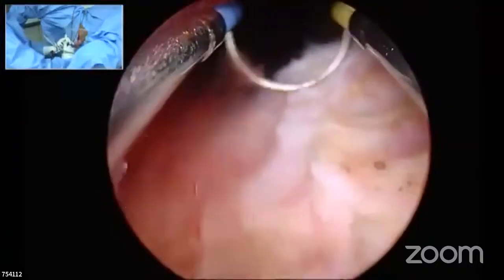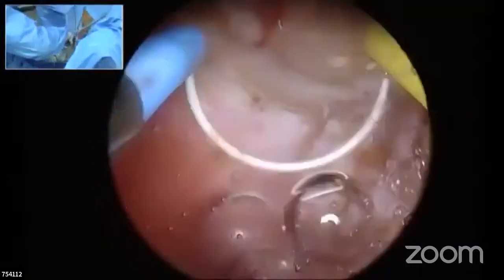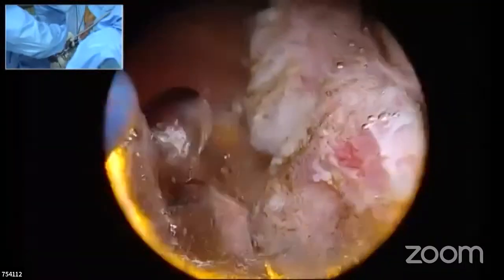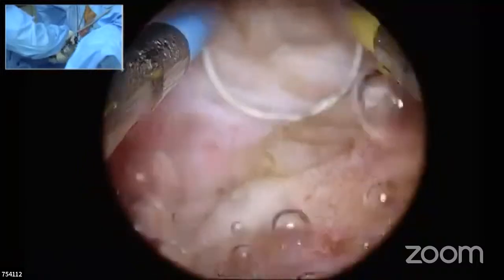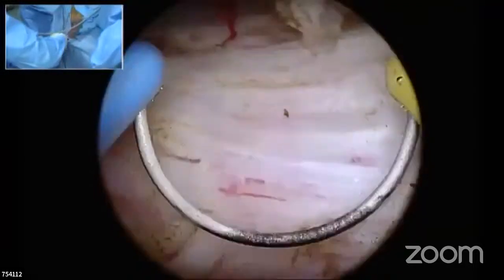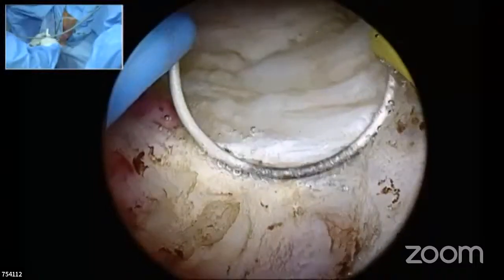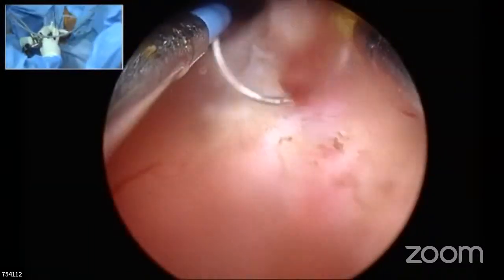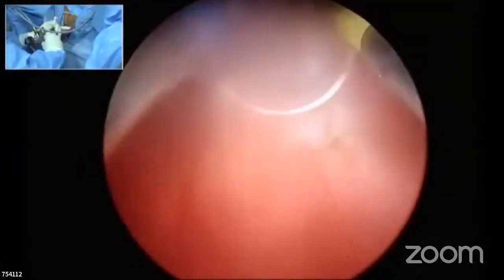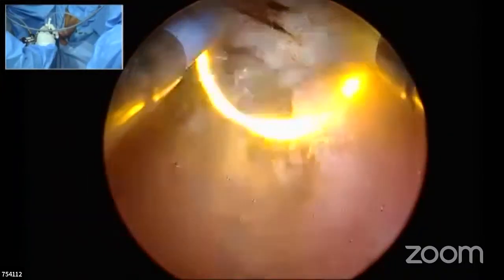Don't cut blindly. Malik, apex is best assessed with a partially empty bladder. Yes, sir. If your bladder is overstretched, you cannot appreciate the apex so well. Empty your bladder and you will suddenly find apex comes at you very clearly to tell you this is where I am. So a relatively empty bladder will always help you in apical resection. What happens is when the prostate is resected significantly, the hydrostatic pressure inside the prostatic fossa will shift this apical tissue laterally, sir. So once you decompress the bladder, it will come into the view very well.